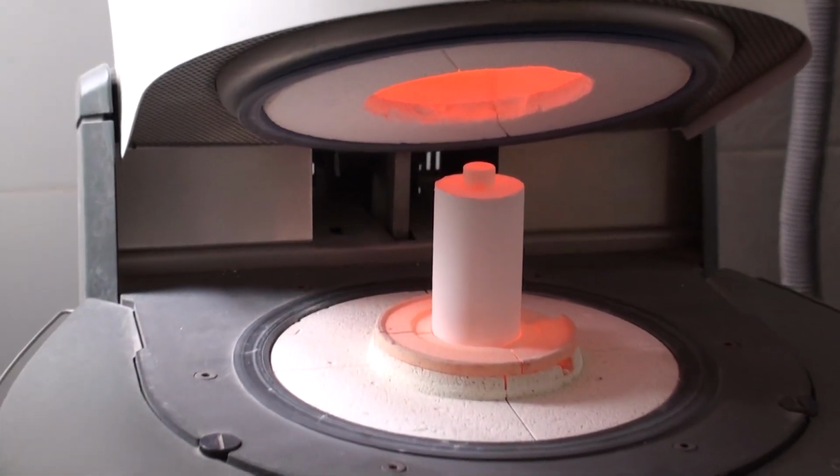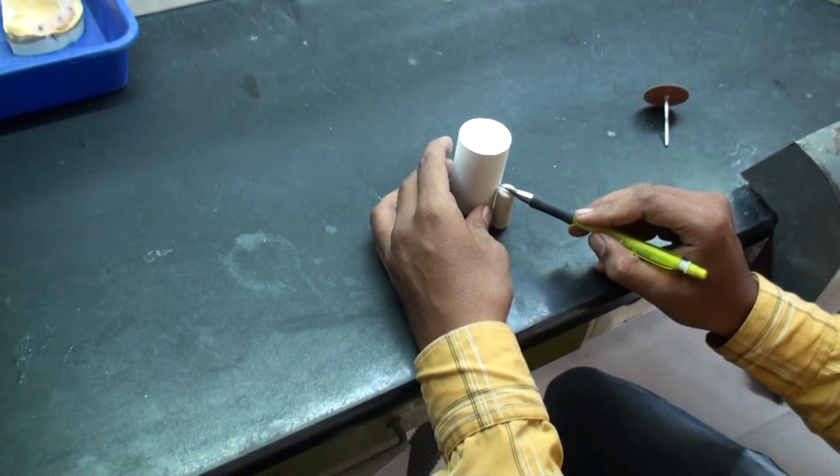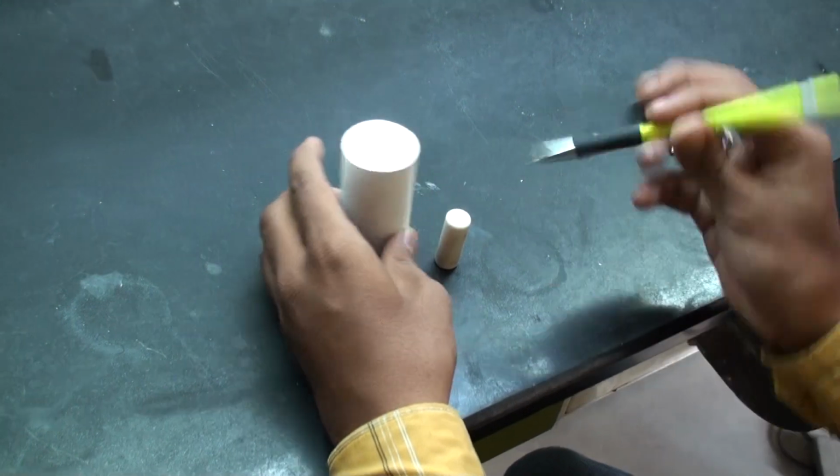Well, it doesn't actually melt, it softens and gets pushed. It gets pressed is the right word. That's the word I want to use. It gets pressed into the area where the wax has been removed.